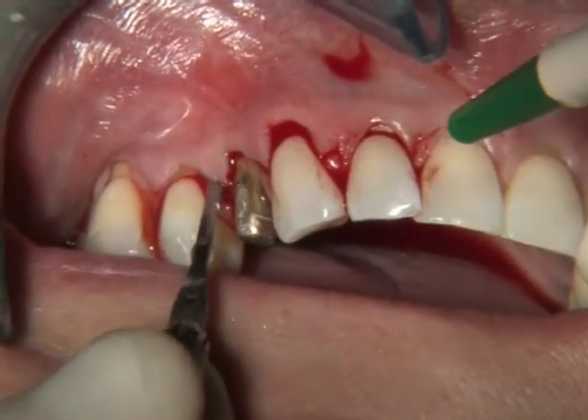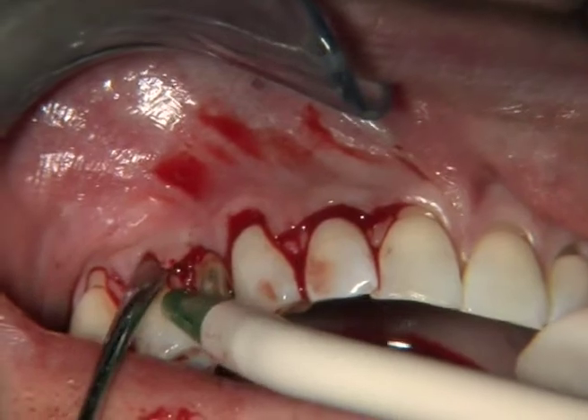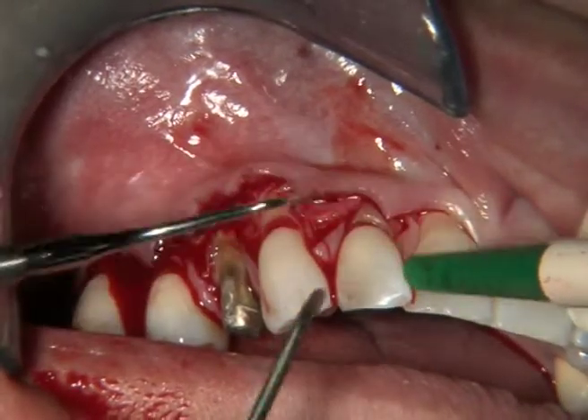I'm preparing every single surgical papilla with my small knife. I want to reach the bone crest for every single tooth. This is where the muscles of the lip insert in the periosteum.